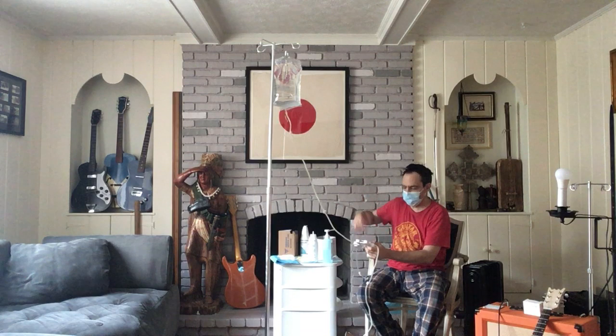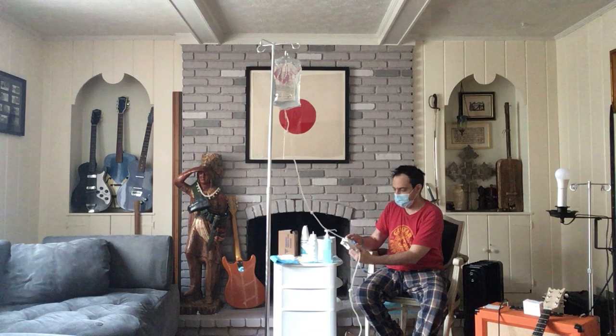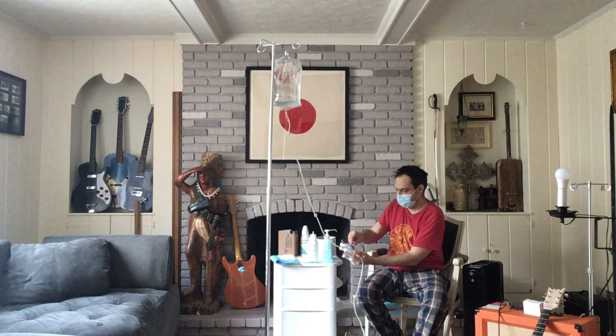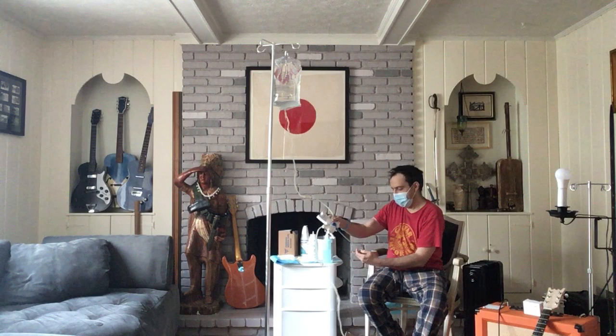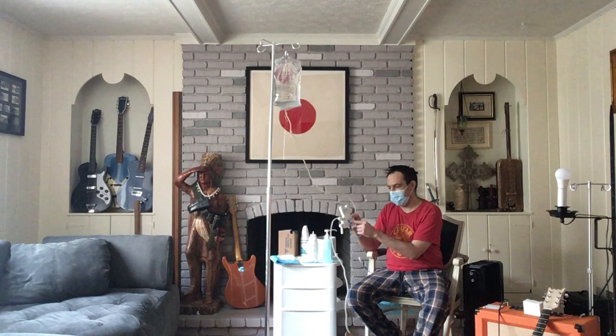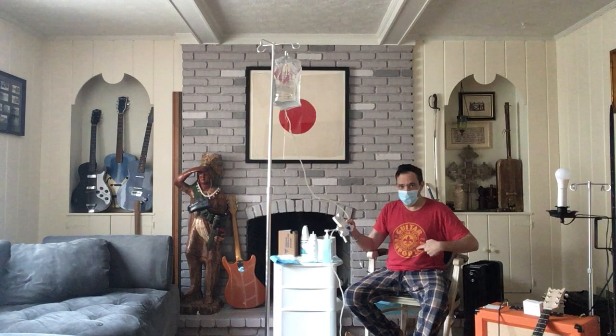All right, so we take our extension, loosen it up slightly, take this off, and connect. Okay, now we're attached to the system. Now we're going to unclamp. The dial is in a drain position, which means the fluid that is inside of me right now is coming out. This is fluid that I put in earlier, about 4 hours ago.